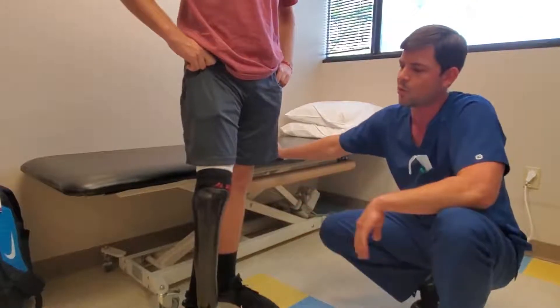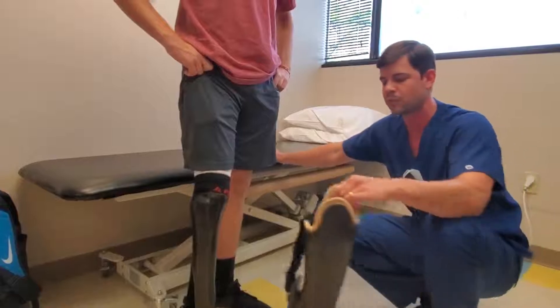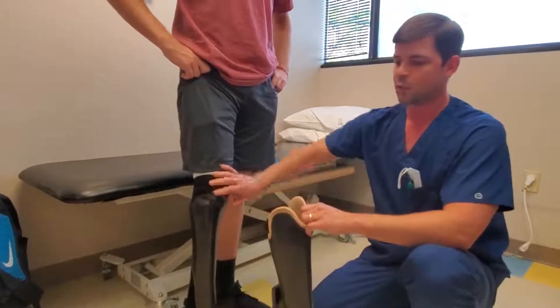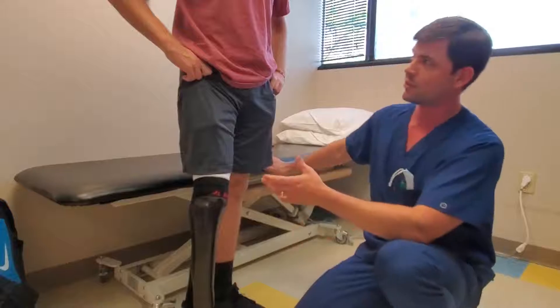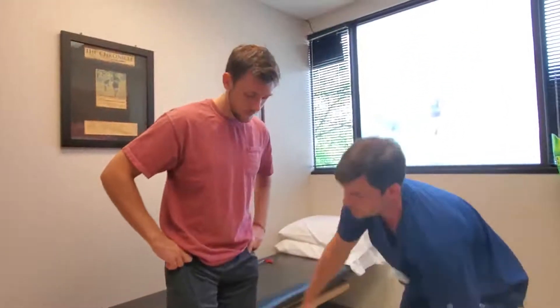Anytime you can promote the patient using their own muscles to control the prosthesis — rather than having the prosthesis control them — we feel that leads to a healthy joint capsule and healthy muscles long term. So now that Alex has had this foot and socket for a few days, what things has he noticed that he's liking and figuring out for himself?